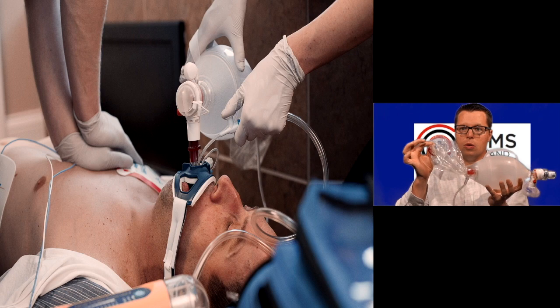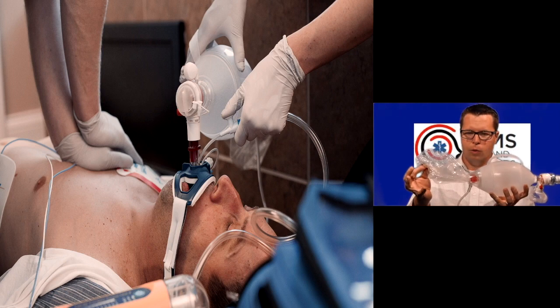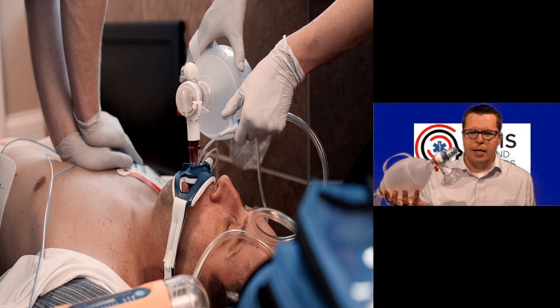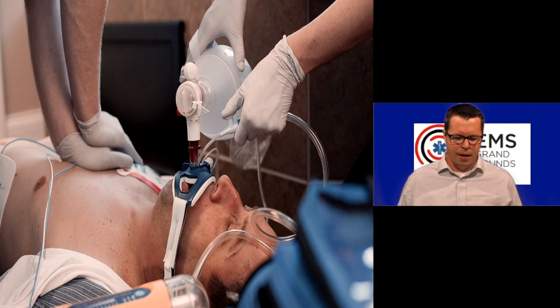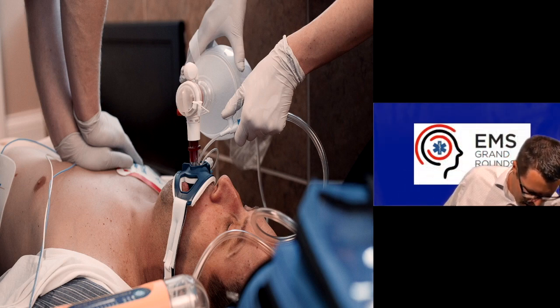If you hook this up to freely flowing oxygen at greater than your minute ventilation, then it will draw in theoretically 100% oxygen. And different designs, different types of bags all actually deliver different concentrations of oxygen, anywhere from about 50 to 60% up to about 90%, depending on the style of bag that you have. That's the basic anatomy of it.